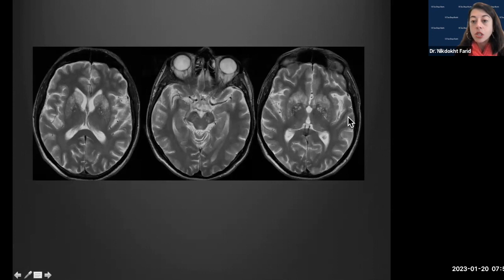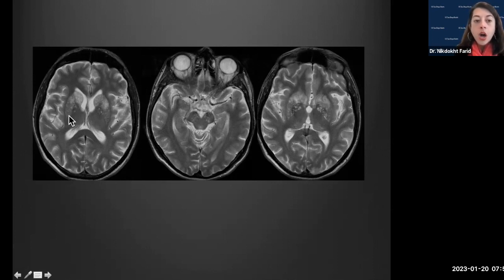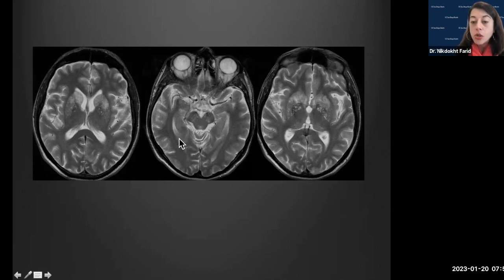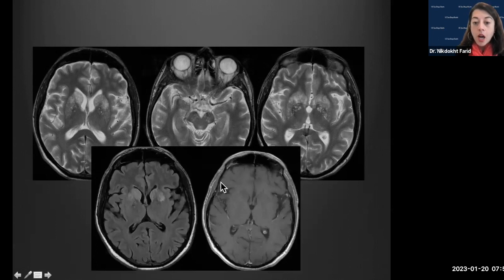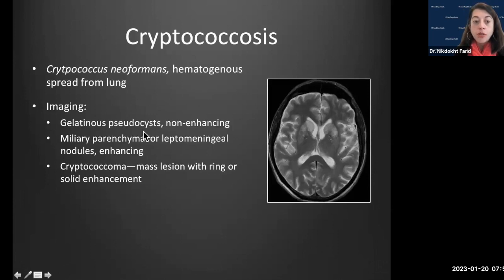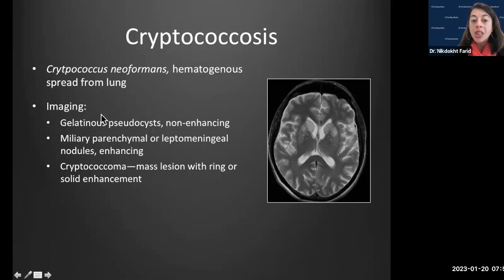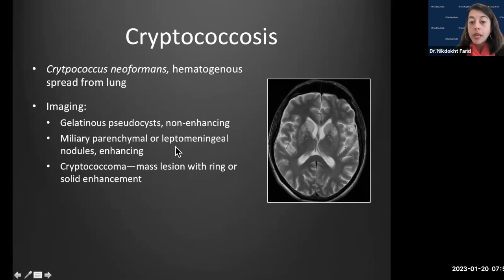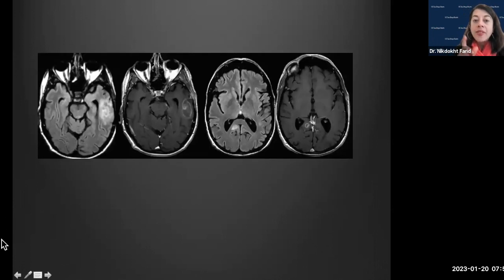Our last unknown case shows axial T2 images with tiny cystic lesions within the caudate, putamina, and cerebral peduncles in an HIV patient — gelatinous pseudocysts in the basal ganglia, a classic pattern for cryptococcus. Cryptococcus usually spreads hematogenously from the lung. It can also produce a miliary parenchymal pattern, a leptomeningeal pattern, or a rim-enhancing lesion called the cryptococcoma.